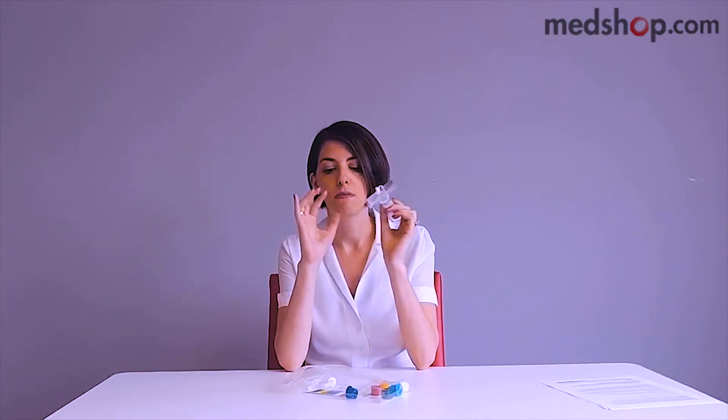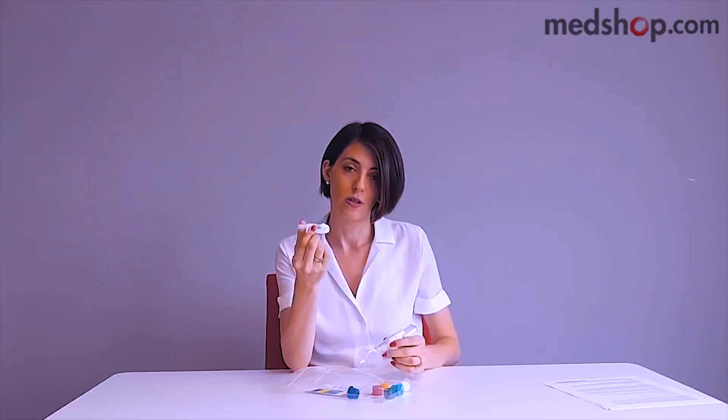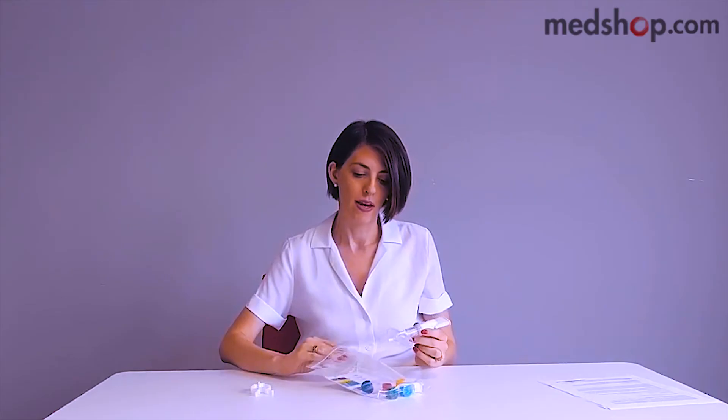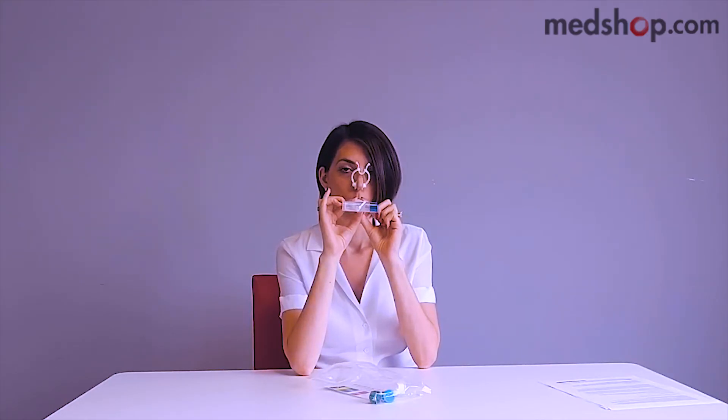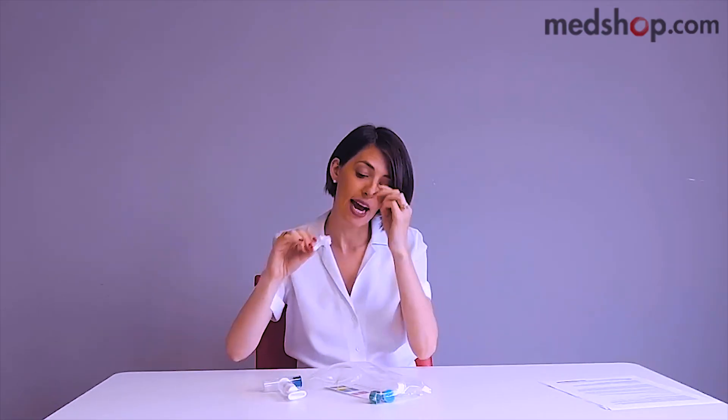Get yourself seated on a comfortable chair, plant your feet on the ground, and take out the mouthpiece. You're going to want to clip your nose with a nose clip. This way, all the energy and effort is coming out of your mouth as opposed to through your nose. We're going to start off with the dark blue, the seven millimeter resistor, and you just enter it into the end of the T here — just plug it right in. Then take the nose clip, put it on your nose, and breathe. And it's as simple as that.